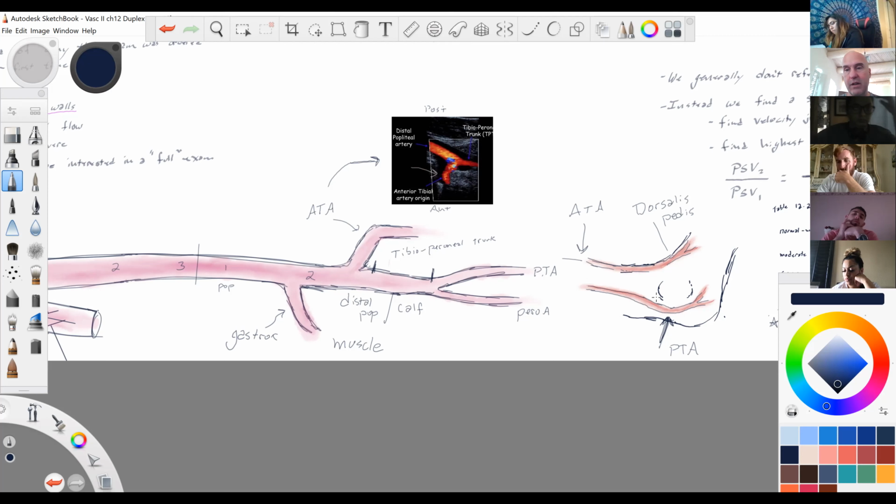And like I said earlier, the other thing is the possibility that this is an emergency. Quick, tell me what's going on. Quick, tell me what's going on doesn't mean starting at the groin and working your way down. It means going straight to here and finding out what's going on. Geez, doc, I can't find any flow. That's what I was afraid of. Let's go straight to surgery.